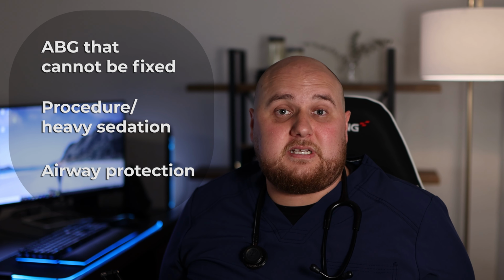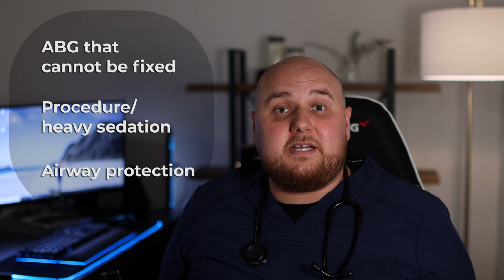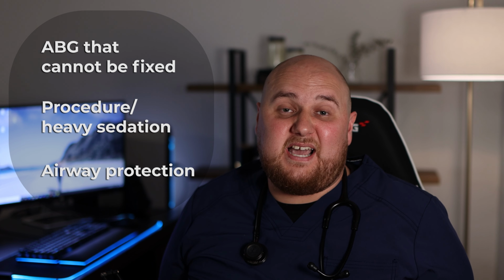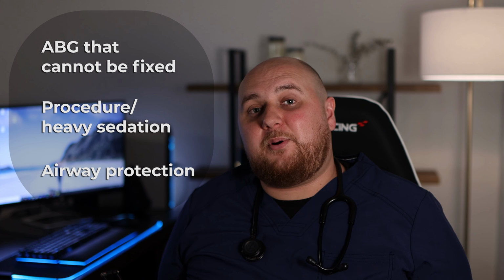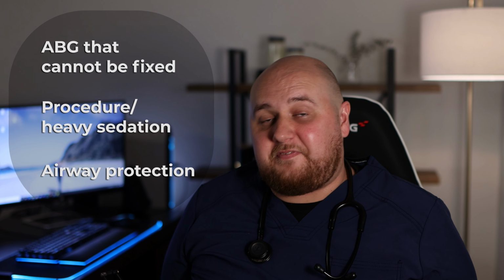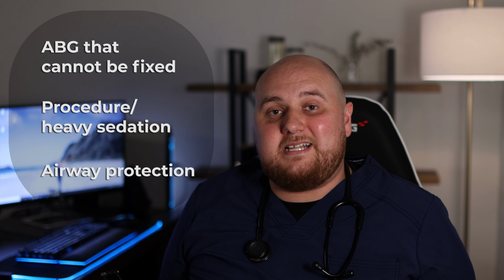Now, in these kind of situations, somebody that has a muscular disease like ALS, or if somebody has MS, or if somebody has Guillain-Barré, those people are going to be put on a ventilator for airway protection. It's also going to be linked to respiratory failure, but a lot of times you're going to do it before they get into that respiratory failure stage. And respiratory failure is a tricky thing. A lot of hospitals determine what that means in a different way. But typically, respiratory failure means you're not able to blow off the CO2 appropriately. And there's also a lot of other objective things like increased work of breathing or some kind of altered mental status due to CO2 hypercapnia.